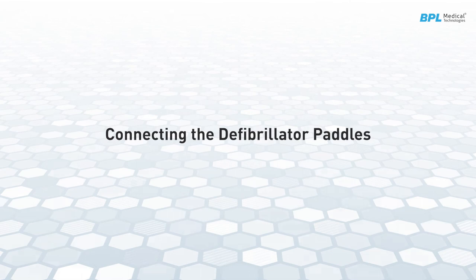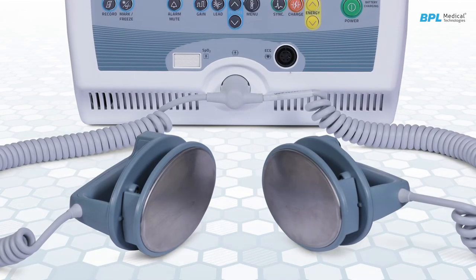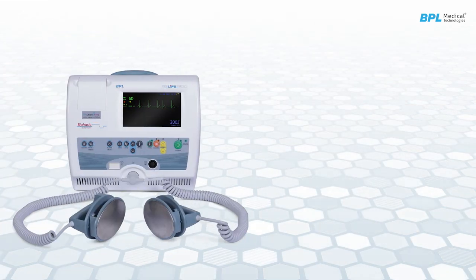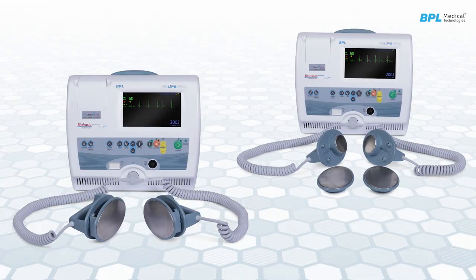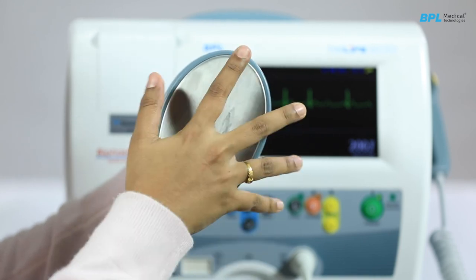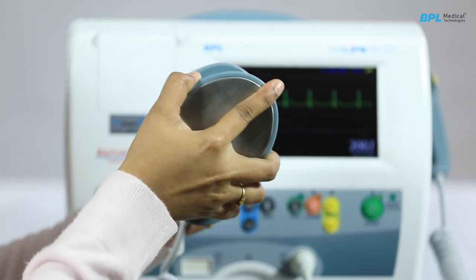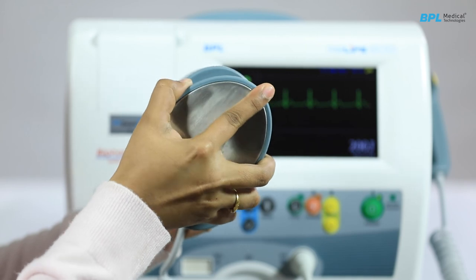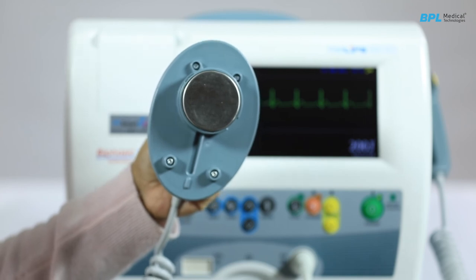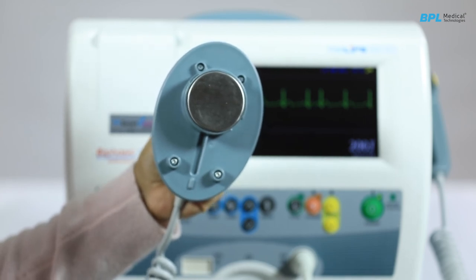Connecting the defibrillator paddles. The defibrillator has standard external paddles which include both adult and pediatric paddles. To expose the pediatric paddles, hold the adult paddle plate and twist the paddle holding its handle. The adult paddle plate will come out fully to expose the pediatric contact surface.